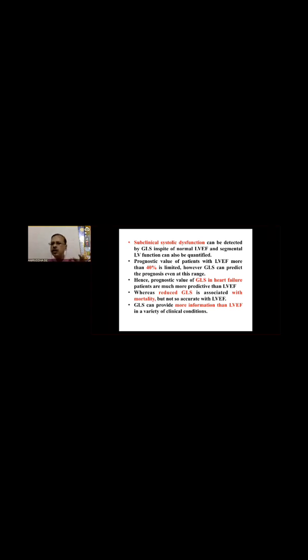There is a very interesting paper on the prognostic value in patients with LVEF. With LVEF more than 40%, prediction is absolutely limited. If it is less than 40%, well, we can predict. However, GLS can predict the prognosis even in this range. Hence, the prognostic value of GLS in heart failure patients is much more predictive than LVEF. Reduced GLS is associated with mortality, but LVEF is not so accurate. GLS can provide more information than LVEF.